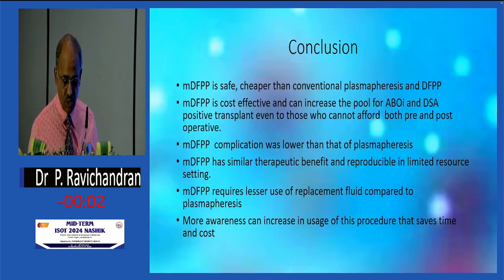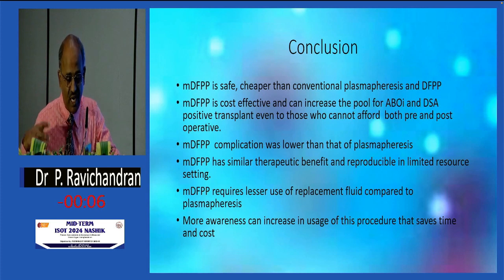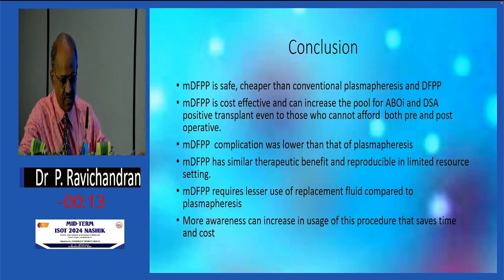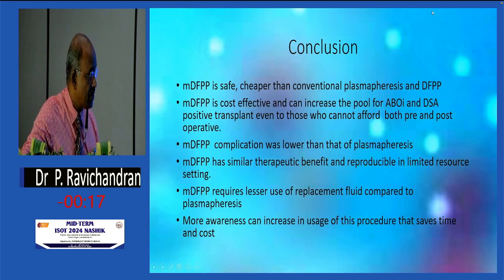So the conclusion is that modified DFPP in the Indian scenario and developing countries is a cheap and safe procedure, and can be used as an equivalent to plasmapheresis. But the only thing is we need to give a little more replacement fluid compared to DFPP.